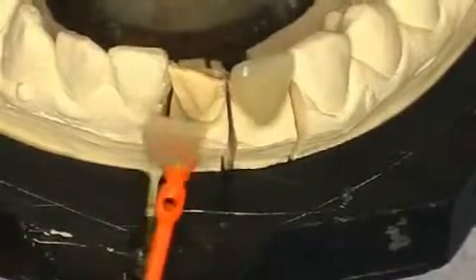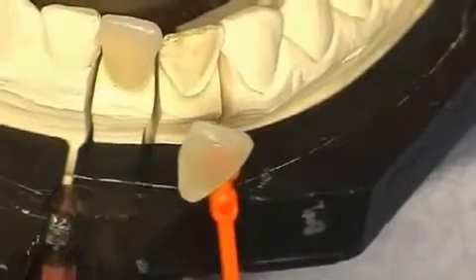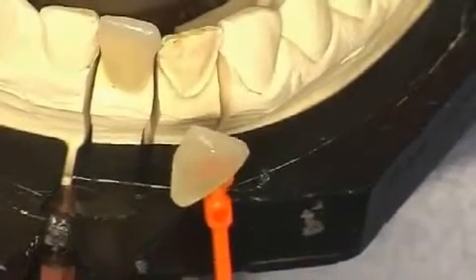The veneer is held and turned with a special stick, orange. The wafer-thin contact lens is made from ceramic. You can clearly see the stick shimmer through the thin shell when the veneer is turned.